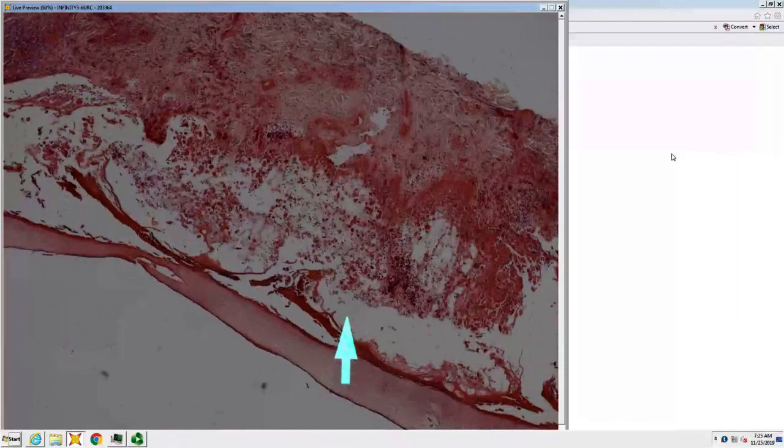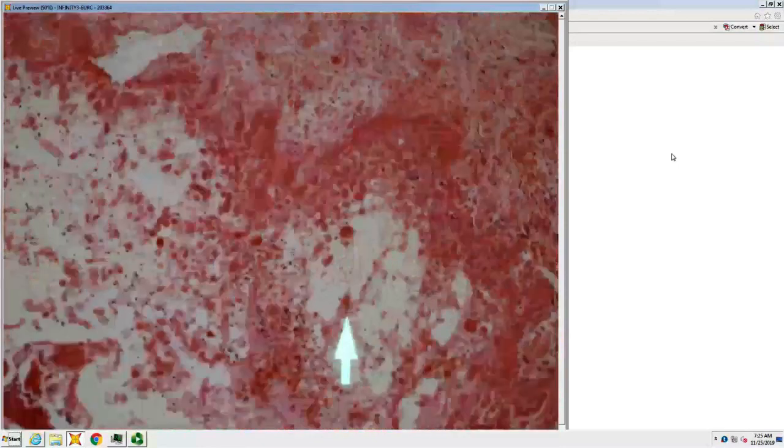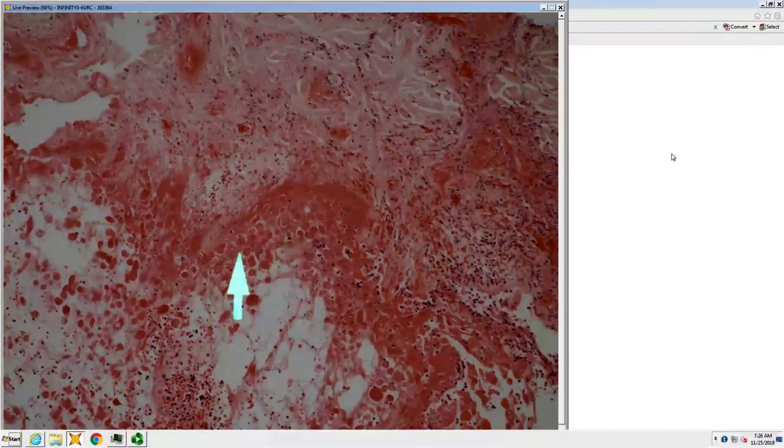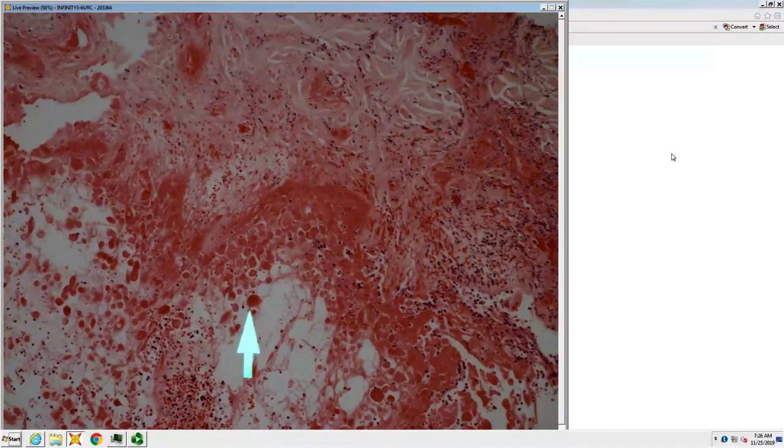So in varicella, you're likely to see the intact nuclei with the molding. In zoster, very commonly, you just have eosinophilic necrosis, but you can still make out there was ballooning degeneration leading to the blister and underlying leukocytoclastic vasculitis, that combination typical for zoster. The other things typical for zoster, anytime you see necrosis of a hair follicle, isolated necrosis of hair follicle, or isolated necrosis of sebaceous gland, think zoster. So necrotic sebaceous gland, necrotic follicle, think zoster.